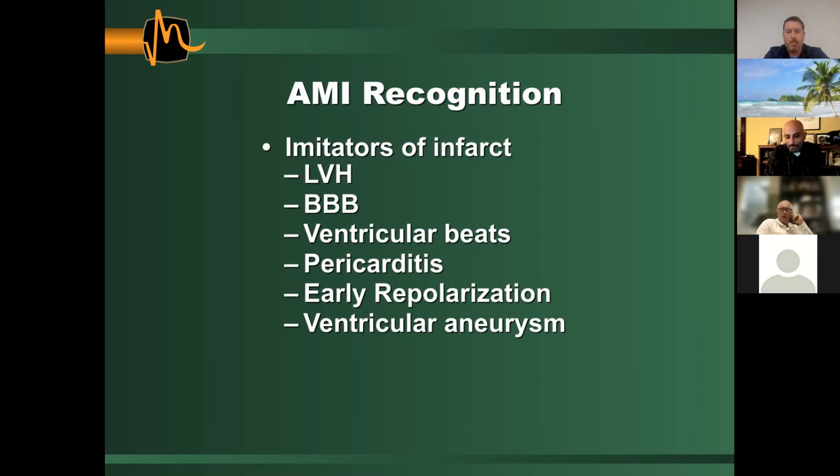But we have the advantage in the hospital of looking at an old EKG and saying, oh, they've had this on every EKG they've had for the past 5 years. This is not an ST elevation MI. We wouldn't expect anyone to recognize that in the field, but just understand there's things that will look like an MI. You'll call a STEMI, and if we say, hey, in the end it wasn't a STEMI, it may be one of these things.